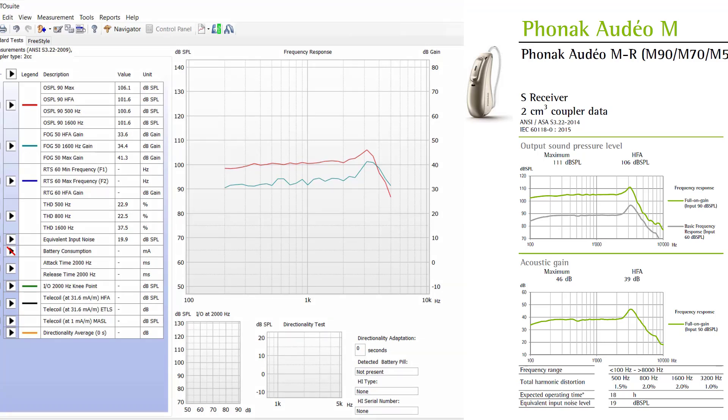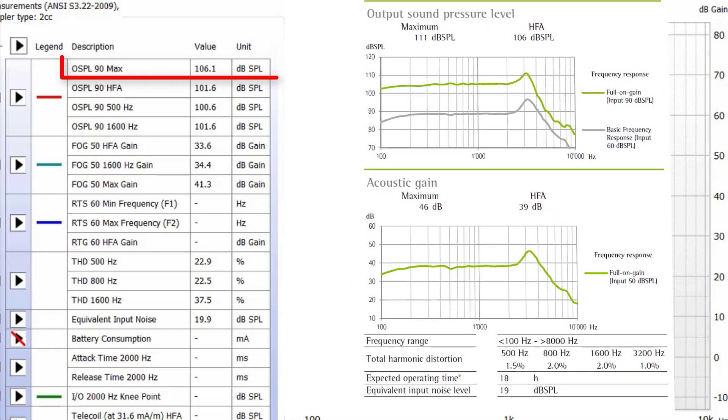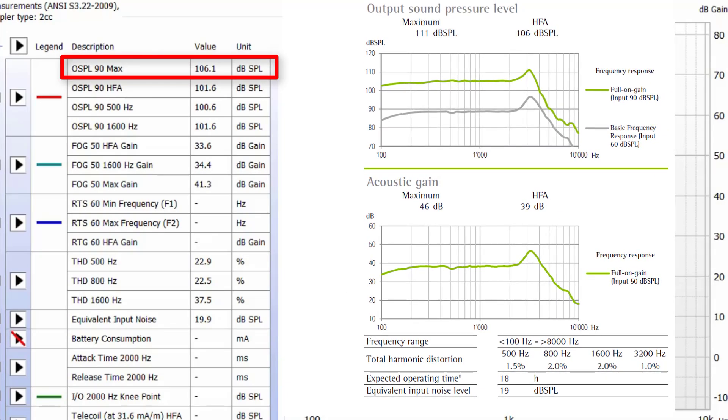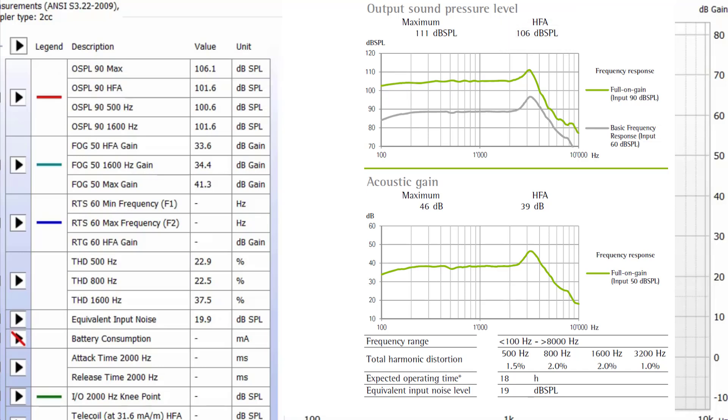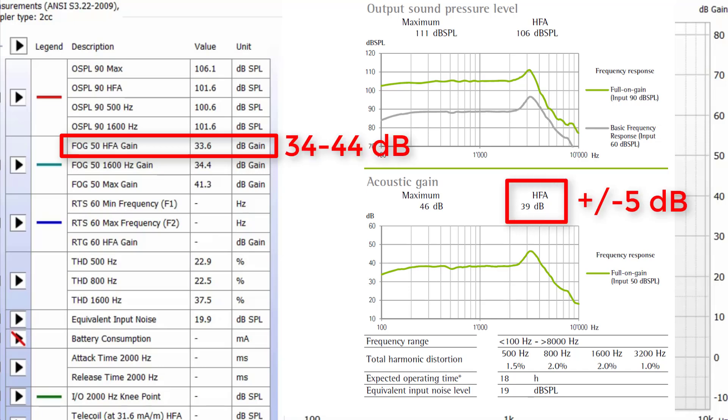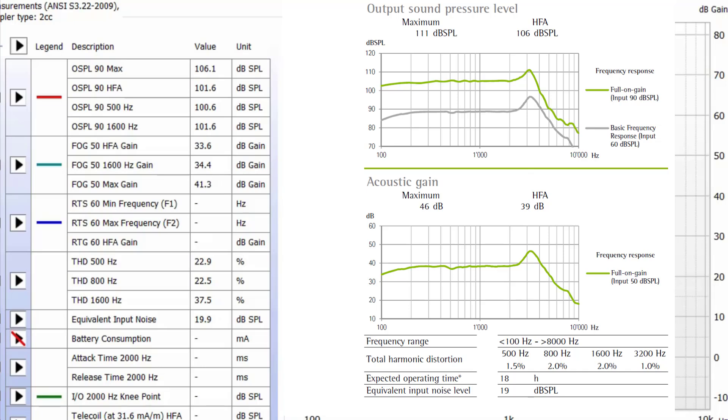Starting with the shape of the curves, we can see that the red curve is looking okay, but the turquoise curve is not as smooth as we would expect to see, as indicated by the spec sheet — this is our first red flag. When it comes to the numerical values with the OSPL-90 Max, we should have an output value no higher than 114 dB SPL due to an ANSI tolerance of plus 3 dB, so we're good there. However, the OSPL-90 HFA should be between 102 and 110 dB SPL — this is our second red flag that this device is not meeting specs, even though it is not significantly outside the tolerance range. Next, we look at the amount of gain the device is producing for a 50 dB SPL input using the FOG-50 HFA gain, which has a value of 33.6 dB but should be between 34 and 44 dB — our third red flag.